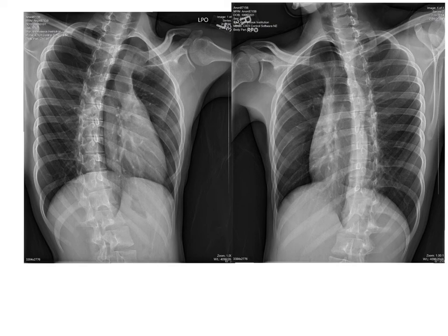If you have obliqued too much, what does that look like? Remember, in a lateral T-spine, you start seeing open IVFs. If you start to see open IVFs back here on your T-spine, you have obliqued your patient way too much. Also, if you start to see the sternum projected more out here, like if you are doing a lateral chest x-ray, that's another sign of over-rotation. I'm going to call that it for the day.